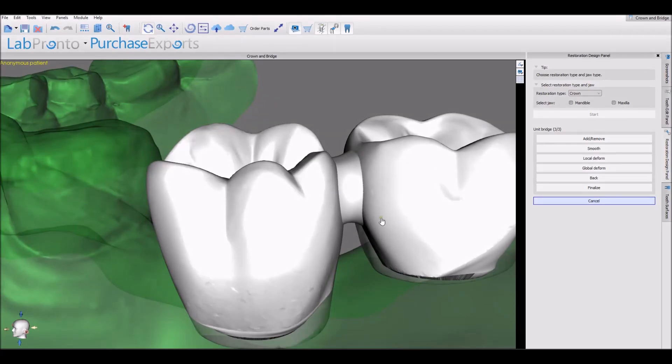The software has created a connection, and if we had multiple teeth here — more than two, if we had three or four teeth — then we'd have multiple connections that we could go ahead and design and modify.